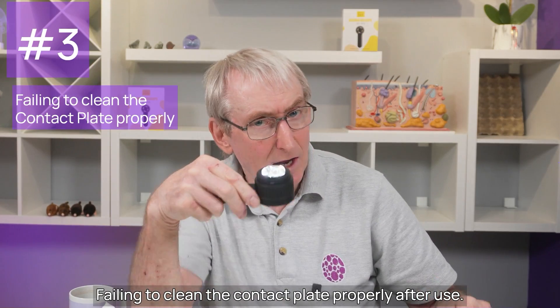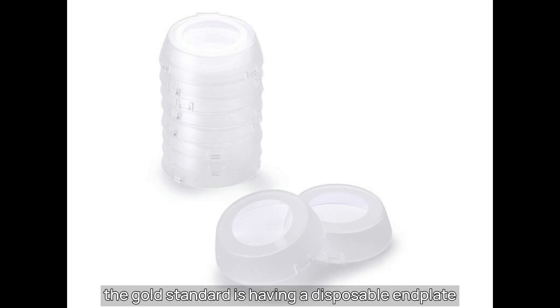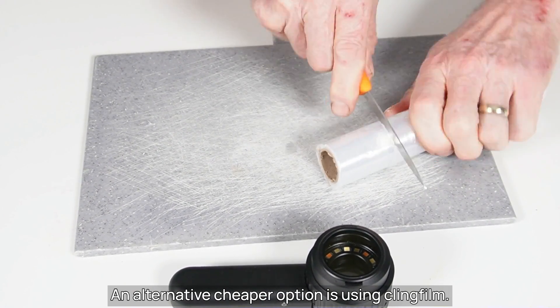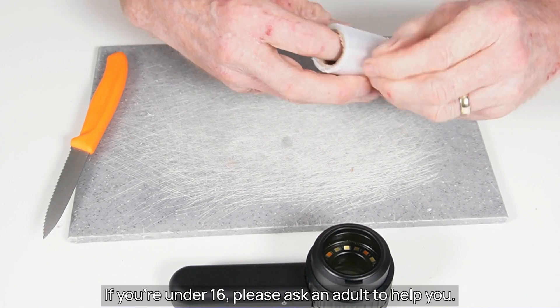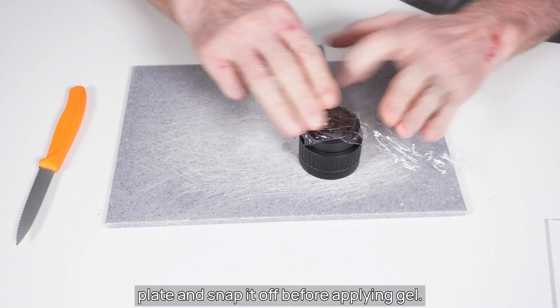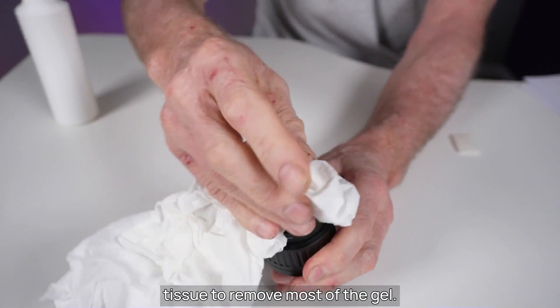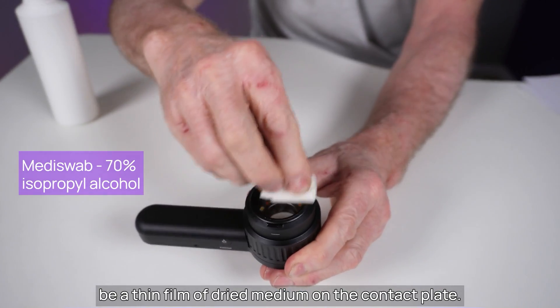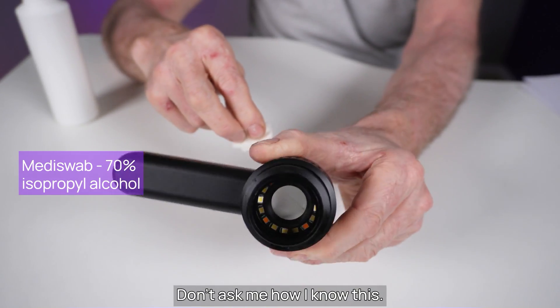Mistake number three: failing to clean the contact plate properly after use. When examining bleeding or ulcerated lesions, the gold standard is having a disposable end plate after each patient, but such disposable end plates aren't available for most dermoscopes. An alternative cheaper option is using cling film — cut off a strip just larger than the width of your contact plate, then roll a piece onto your end plate and snap it off before applying gel. For most dry skin lesions, I wipe the contact plate with a tissue to remove most of the gel, then clean it with a mediswab. If you don't do this, the next time you use the dermoscope there may be a thin film of dried medium on the contact plate — the image will appear blurry and you will wonder if your dermoscope lens is broken.